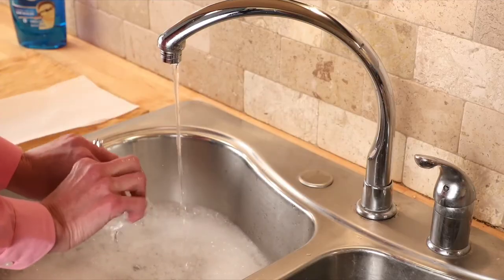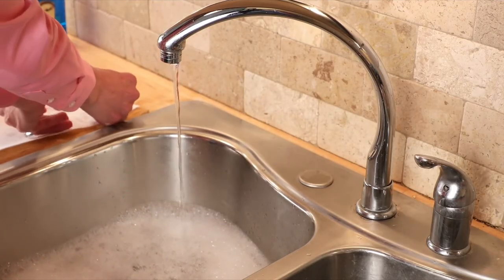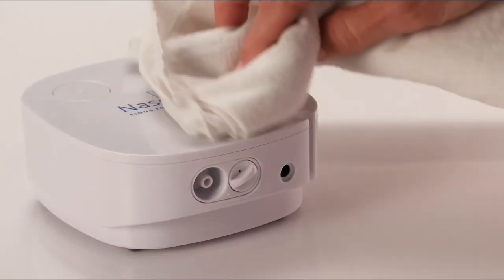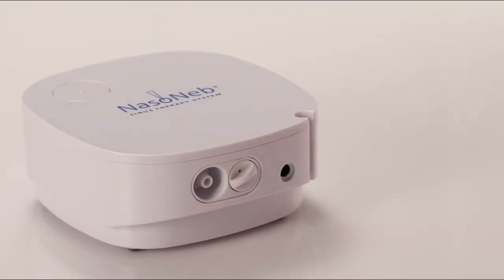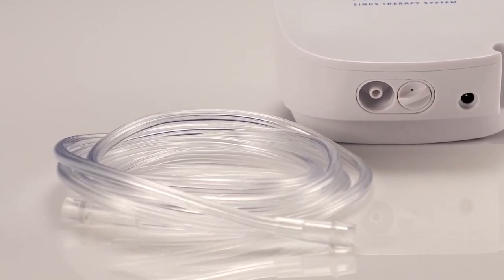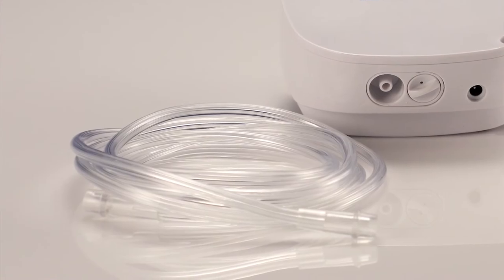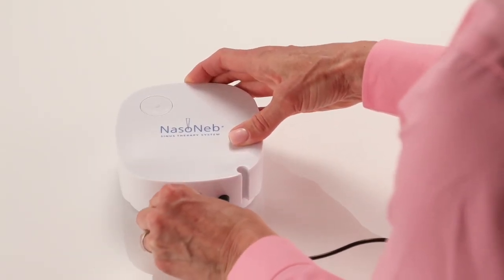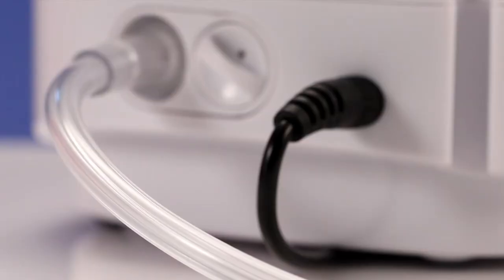Disassemble the system and clean the insert and cup with warm soapy water. Set these aside to dry. Wipe off the compressor and the outside of the tubing with a damp towel. Do not allow water to enter the inside of the tubing. If the inside of the tubing gets wet or you see moisture in the tubing, simply plug one end into the compressor and let it run open-ended until dry.